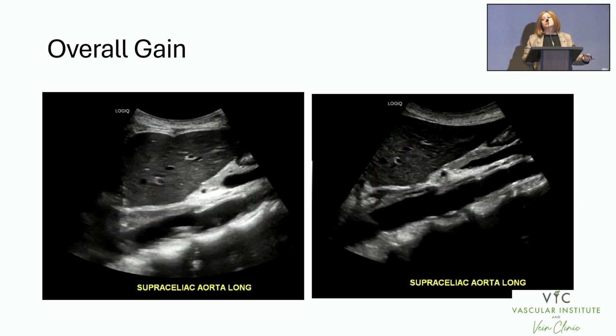So it was an easy patient, and after she came out, she goes, I had a really hard time getting bad images. So I said, I get it, because this patient was really thin and easy to scan. But it just goes to show you how that image that's overgained can change when you clean it up, using what you know about physics and your understanding of the ultrasound machine.